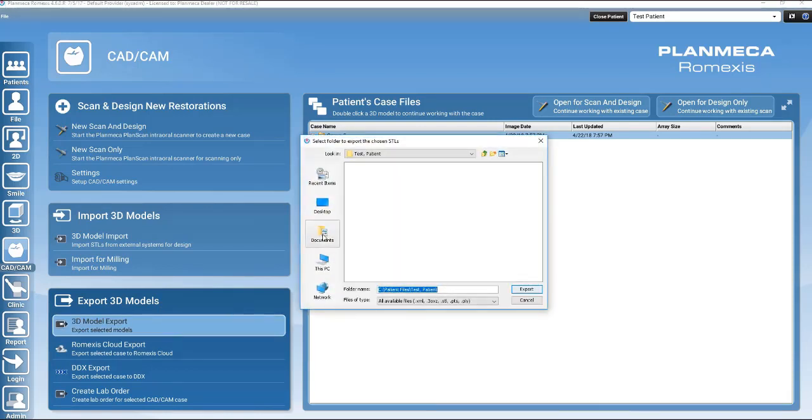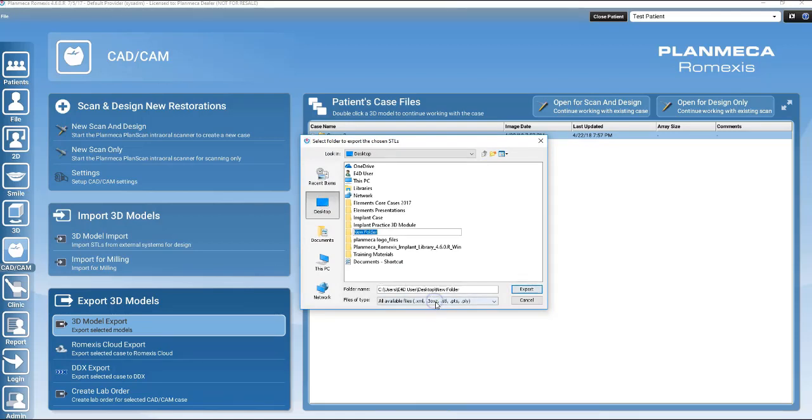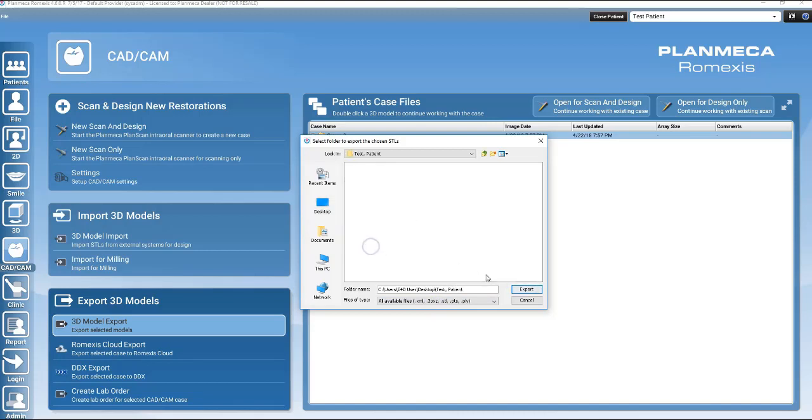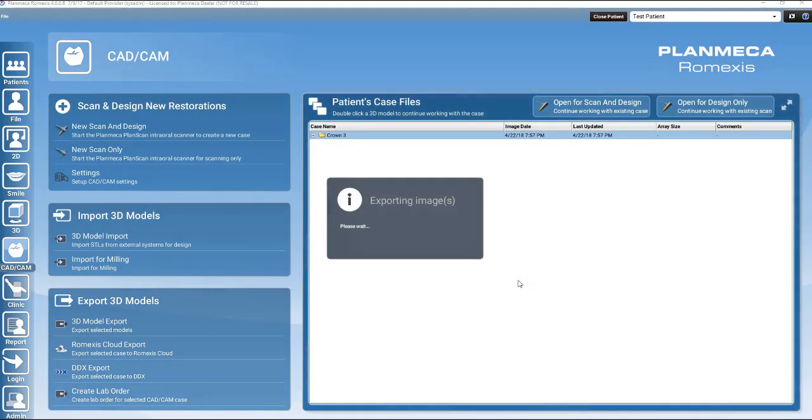A destination folder will need to be selected. It is ideal to create a folder with the patient's name to easily locate the case at a later date. Click on Export. Romexis will then export all the data located within that yellow file folder to the designated location.